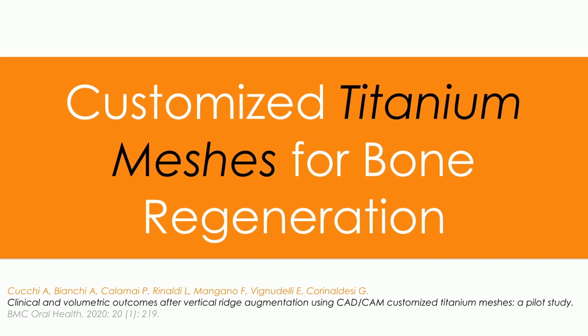We have published it with Dr. Alessandro Cucchi, my friend, who is one of the most important experts in the world on this surgical technique, this paper on a series of cases in which vertical ridge augmentation was performed using computer-aided design, computer-aided manufacturing, customized titanium meshes for bone regeneration.